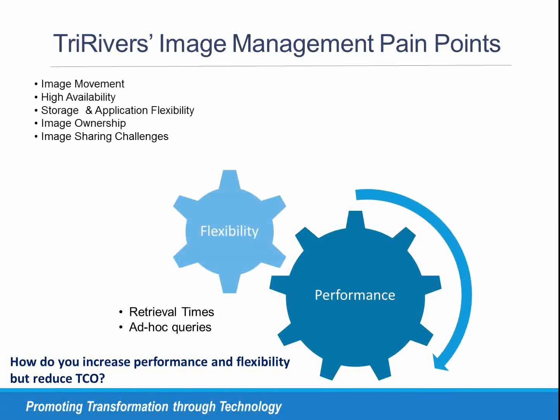One of the things that we've opted to do now with Acuo is move our enterprise viewing software completely off of the PACS vendor and the image archive. The enterprise viewing software will be directly accessing the PACS images from the Acuo software. That way when PACS is down, we can still transfer images into the archive, have those queue up for processing into the PACS system when it comes back up, and also offer an imaging solution for accessing PACS studies even when the PACS system is not available.